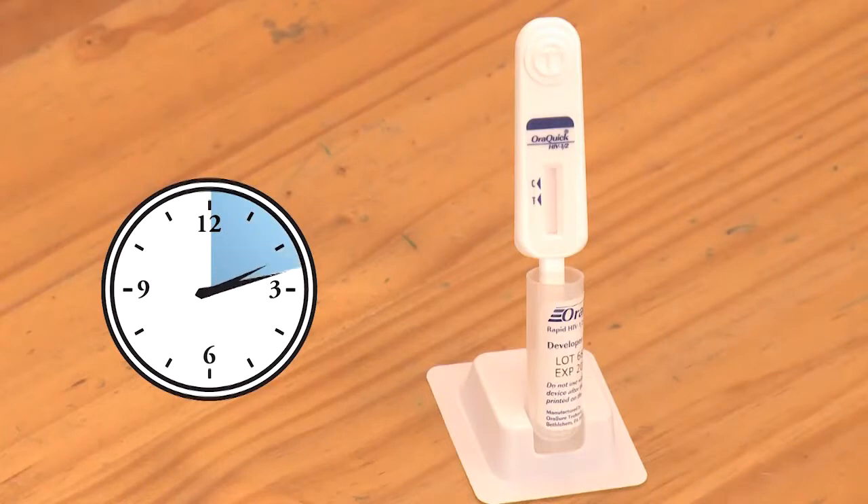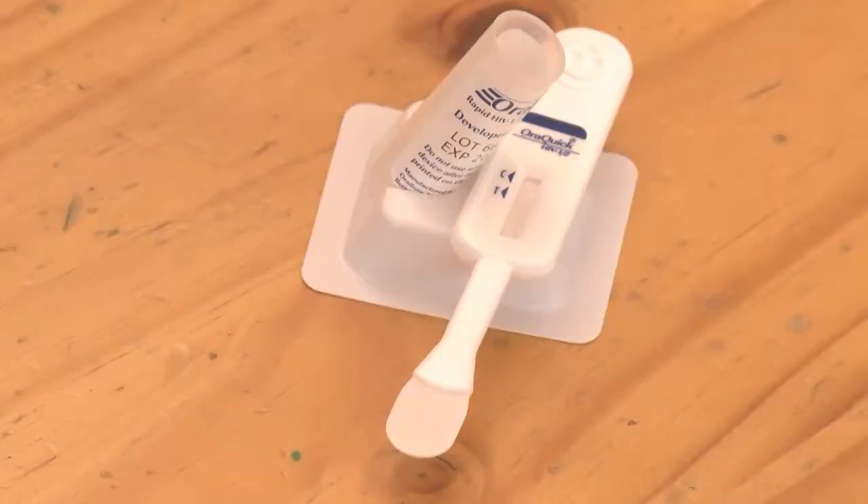Leave the test device in the bottle for 20 minutes. It's now time to interpret your results. Make sure to read your results in an area with good lighting.